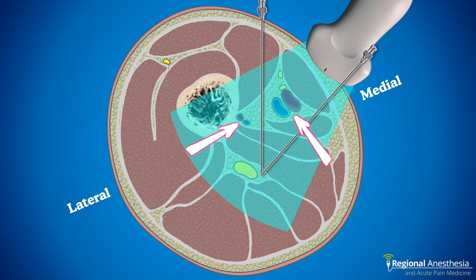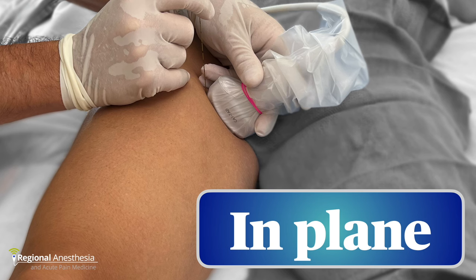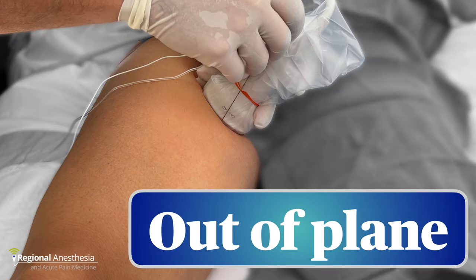Both the superficial and profunda femoral vessels can present challenges to needle trajectory, and you're sometimes forced to abandon an in-plane approach for an out-of-plane, or vice versa. Here's the probe and needle position for the in-plane approach, and here's the positioning for out-of-plane. It's useful to use a curvilinear probe for this block for both the depth and breadth of field it affords.